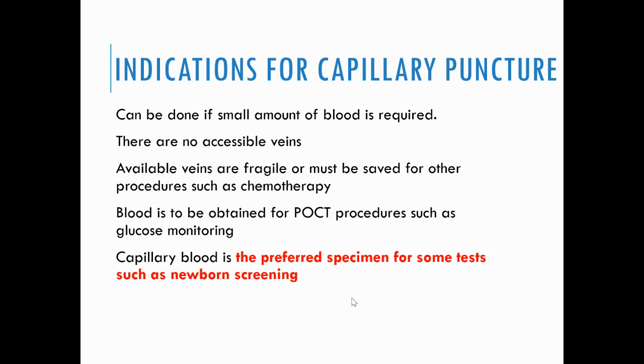Indications for capillary puncture: it can be done if a small amount of blood is required, or kung maglisod na ko kay wala na dyan other sites for venipuncture, kay that is the time perform tag skin puncture and katong gamay nga tube ang ato ang gamiton. Ito yung nakita before. Or pwede sad capillary puncture ka kung fragile kay ang veins nga naa and naay mga other arm nga nakasave for dialysis, nakasave for chemotherapy, nakasave siya kay kanang na-injury, nga wala na dyan kay site makuhaan. So that is the time pod nga pwede ka for capillary puncture.